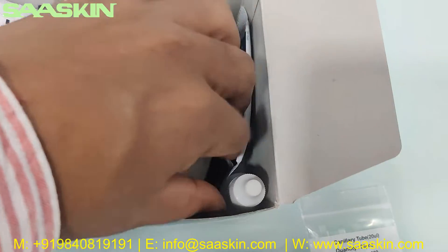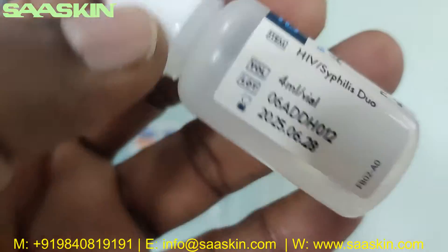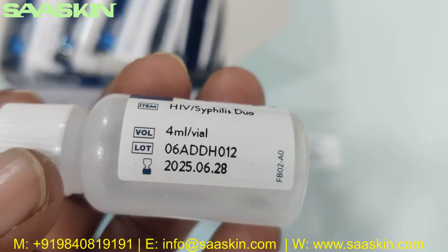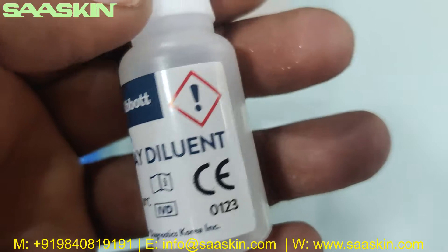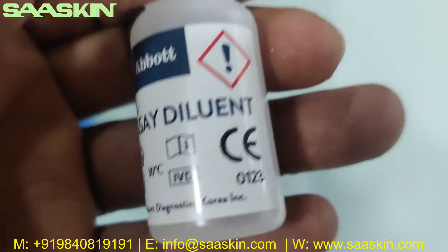Further inside, you get one Assay Diluent Buffer solution — a 4 ml vial labeled Abbott Bioline HIV Syphilis Duo. The lot number and expiry period are written on it. It is CE certified.